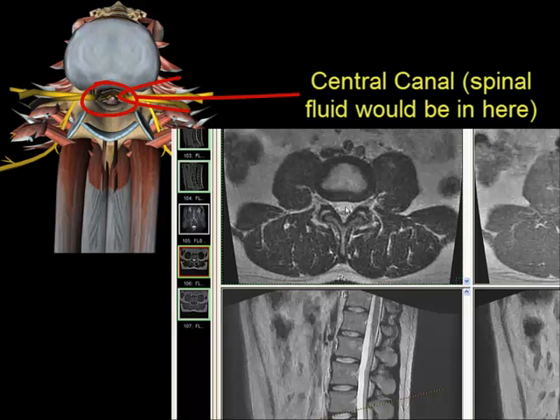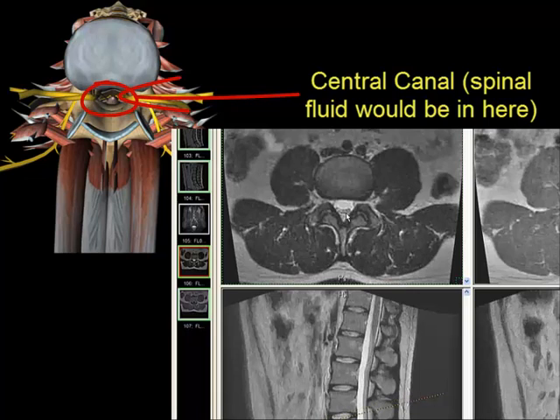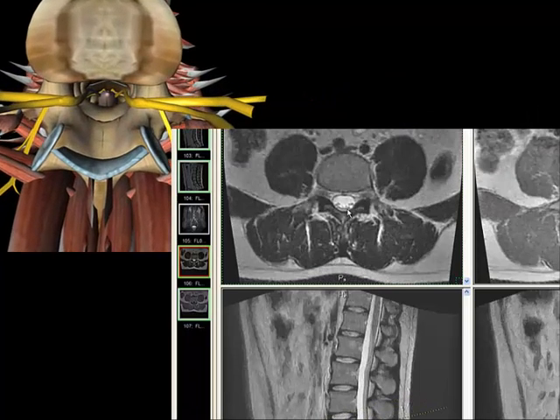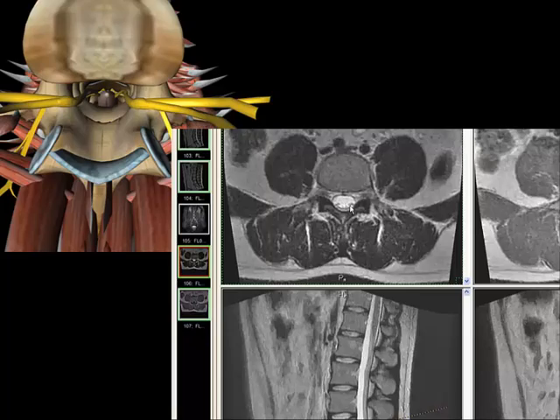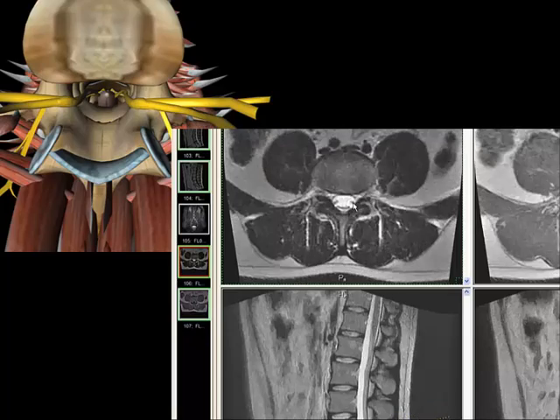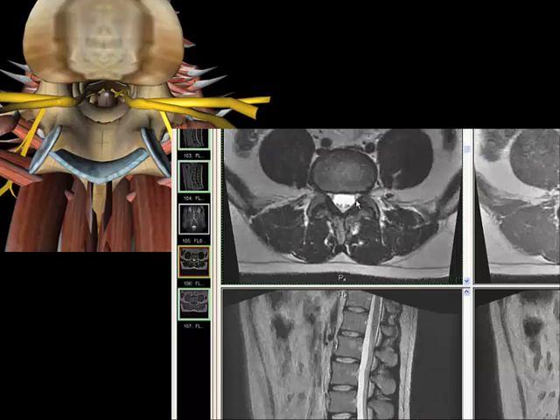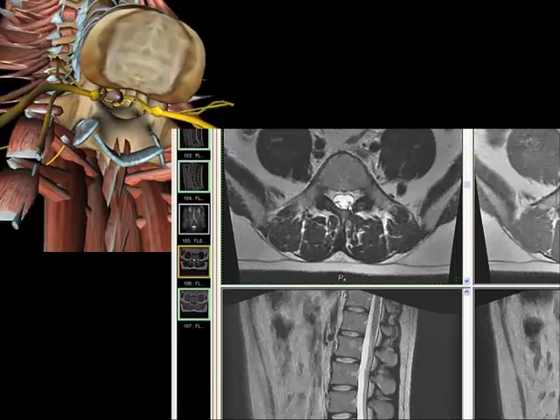This is spinal fluid — the bright part anteriorly. These are the nerve roots down below. As I click on these images and make my way inferior, you can see the pairs of nerve roots make their way toward their neural foramen.